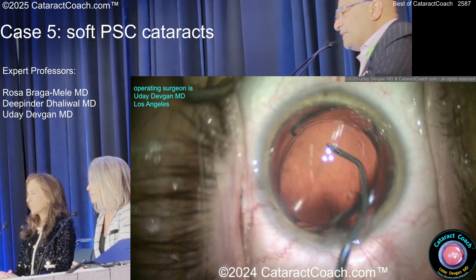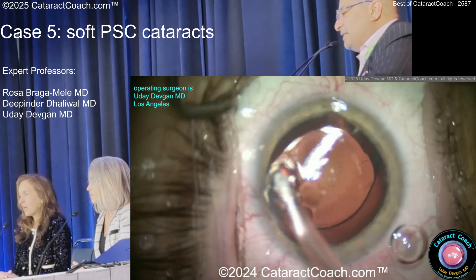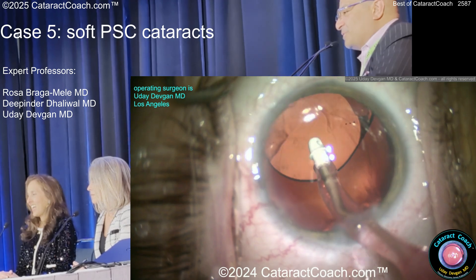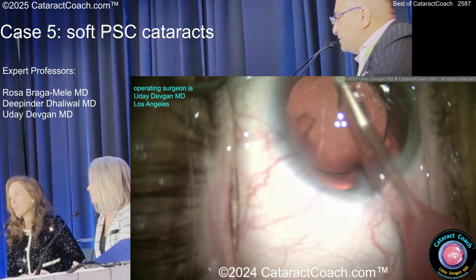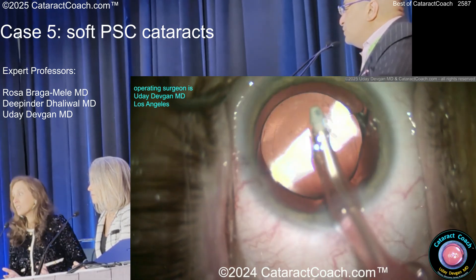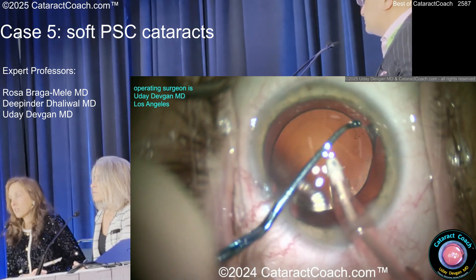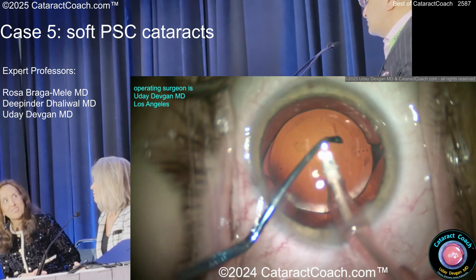Looks like a toric lens — got to get that in the bag, obviously. Lined up appropriately. Rhexis looks reasonable. I would have absolutely put a CTR in this case — really, yes, with those zonules and the initial stria. Because it's a toric also, you don't want it to rotate. Do you size your CTRs? Yeah, I size them like you're supposed to.